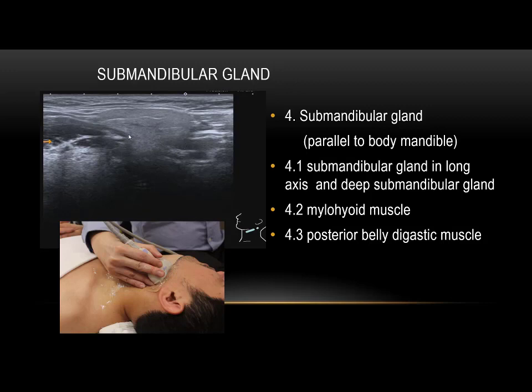If you tilt up and down beautifully, you're going to get part of the submandibular gland, and you can notice some part of the gland is deep down here, beneath this area. This is the deep part of the submandibular gland, and sometimes it is submerged into the sublingual gland, the sublingual space.